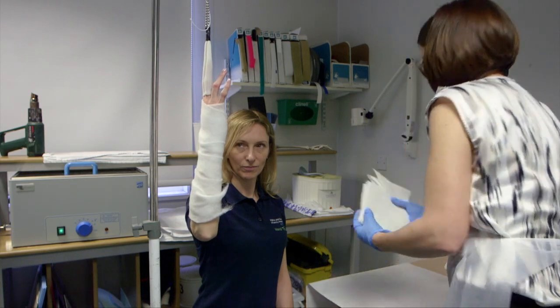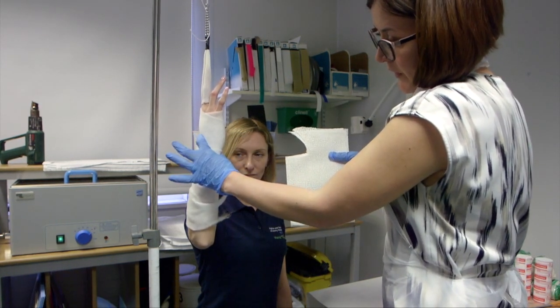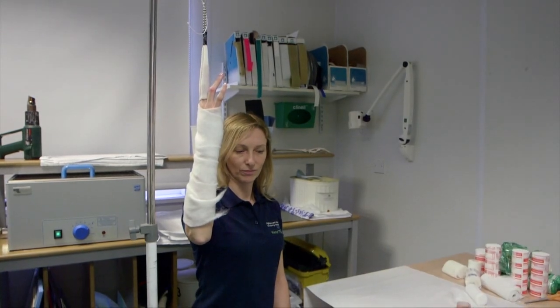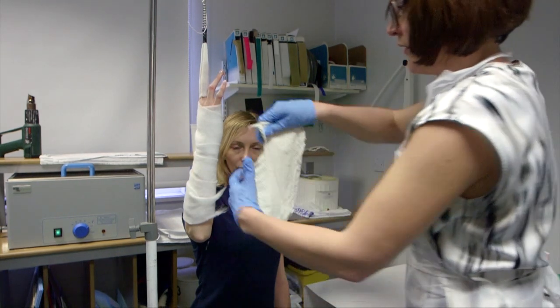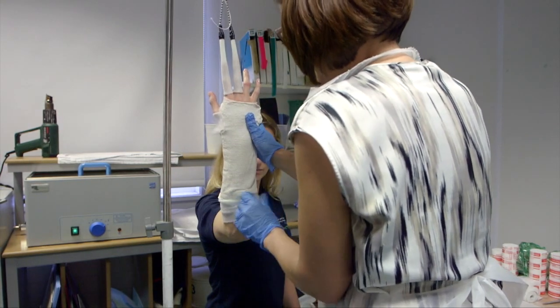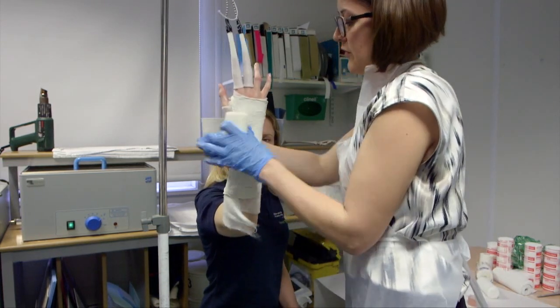With the plaster, it's important that you have the radial aspect to the dorsal slab. We need to apply three-point molding at the fracture site, and we can only do this if we have plaster on the back and on the side of the radius. It's important that we get dorsal coverage and also around the radial side. Always apply the bandage coming out through the thumb, through the first web space, to prevent contracture of the first web space.